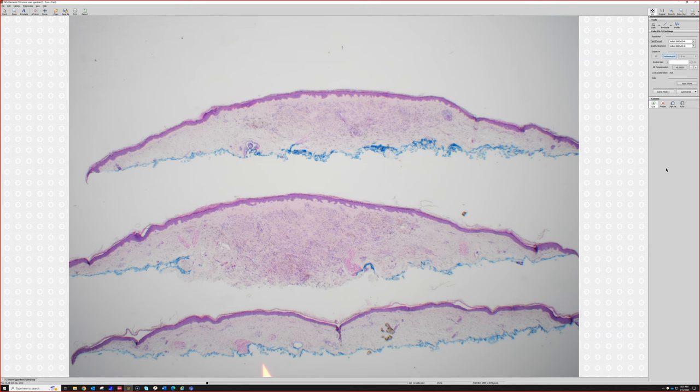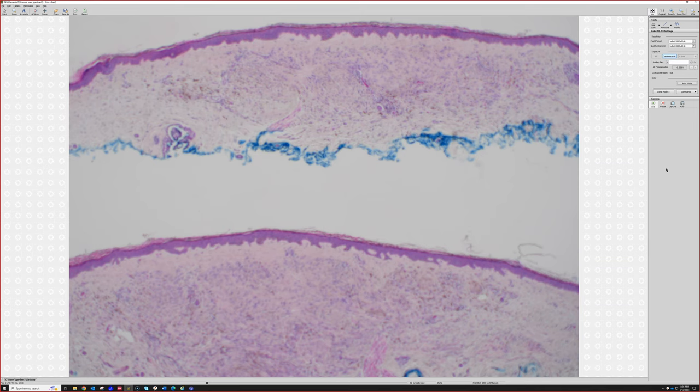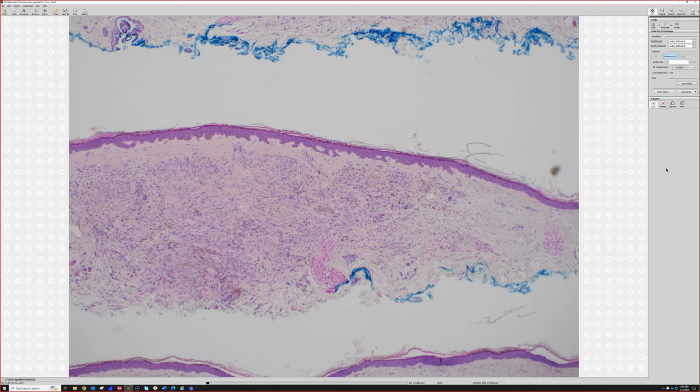So the one clue that helps me the best from low power to favor blue nevus is if there's not much epidermal hyperplasia. Usually, dermatofibromas get epidermal hyperplasia with flattening of the rete ridges, and blue nevi don't. But look here, this case is an exception. I'd say that's some tabling. Elongated rete, they're flat at the bottom. Yet it's still a blue nevus. So the rules get broken sometimes. But generally, I think blue versus DF was a very, very fair thought from low power, especially.